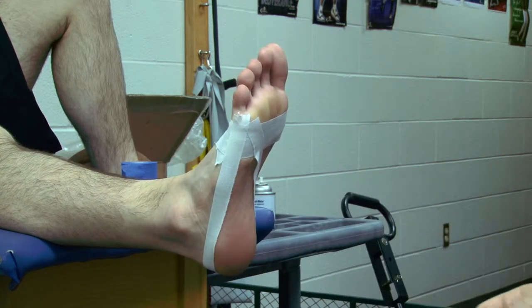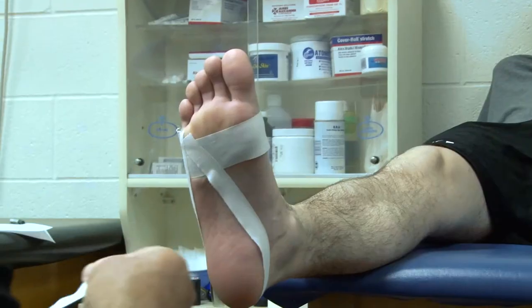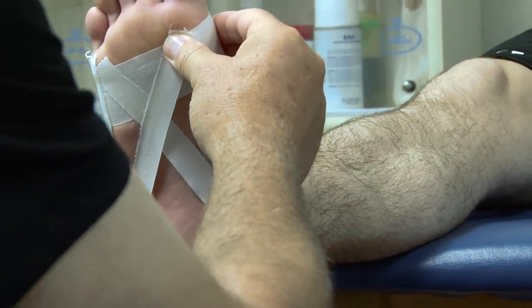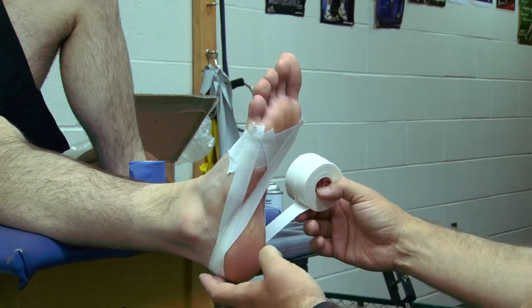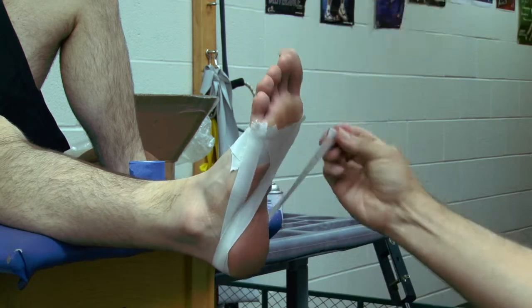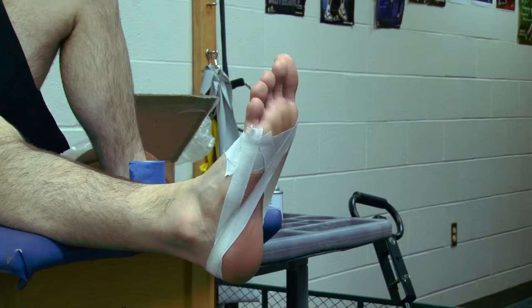The second strip, I'm going to stay on the same side of the roll of tape. I'm going to do just the opposite — lateral side, first metatarsal head, come over the top of the same place on the first strip, and bring that up to where I started.